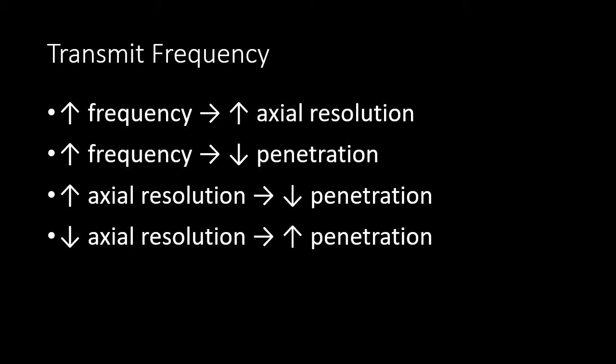When we think about how transmit frequency impacts image quality and our attempt to optimize our imaging, remember, increasing the frequency increases our axial resolution, so our superficial to deep resolution. When you increase the frequency, you decrease your penetration. Therefore, high frequency probes cannot be used to image deep structures. This trade-off of axial resolution and penetration is essential for understanding which probe to use in which setting and what you may sacrifice if you're trying to image a very deep structure.